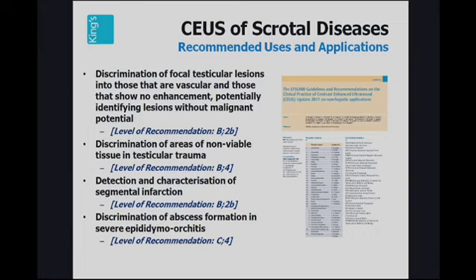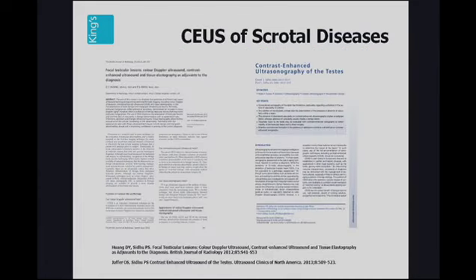It's important to know and to realize that these are findings based on very little literature at present. This will change in the future, but the main use of contrast-enhanced ultrasound is to demonstrate those areas of vascularized tissue from non-vascularized tissue. This in the future will be the most important use of contrast-enhanced ultrasound in the testes.